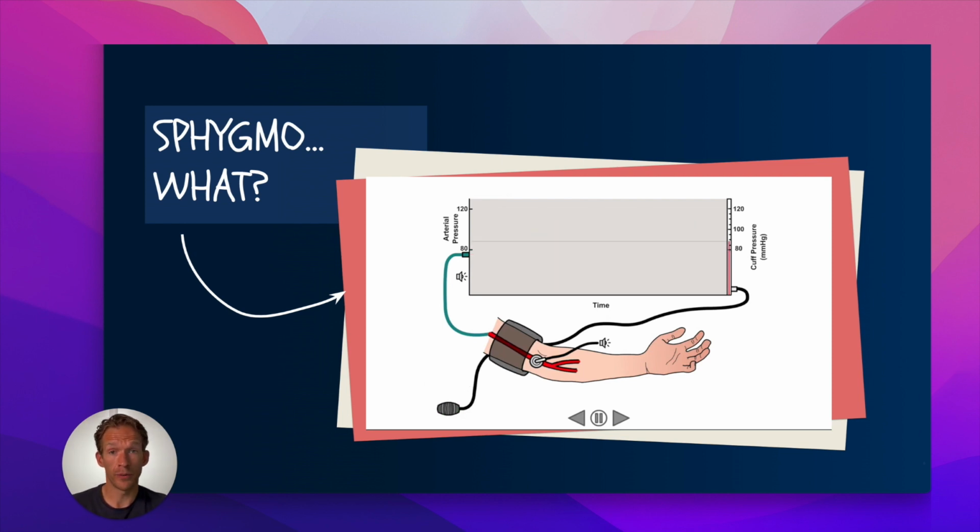Right, so now the cuff is going to be inflated.